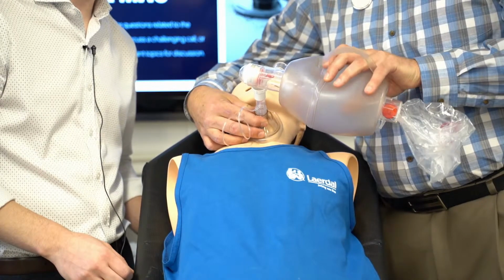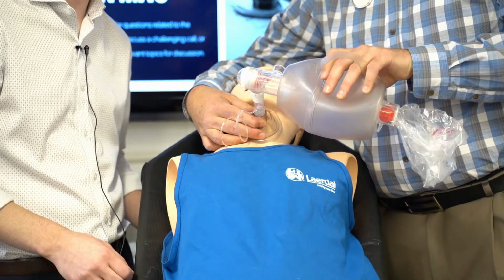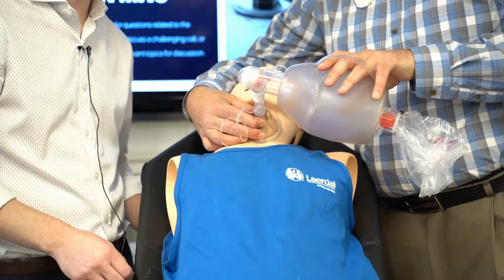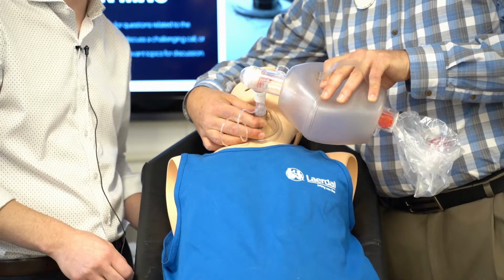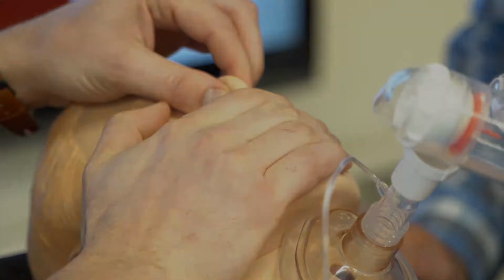Now, ventilating this way is very easily done in the laryngectomy patient because there's no actual connection to the oropharynx itself. It becomes a little more complicated with a tracheostomy patient, and that's because there's an actual connection between the trachea and the oropharynx. Now to generate the positive pressure that's needed for this patient, we're going to have to go ahead and cover the oropharynx and the nose itself.